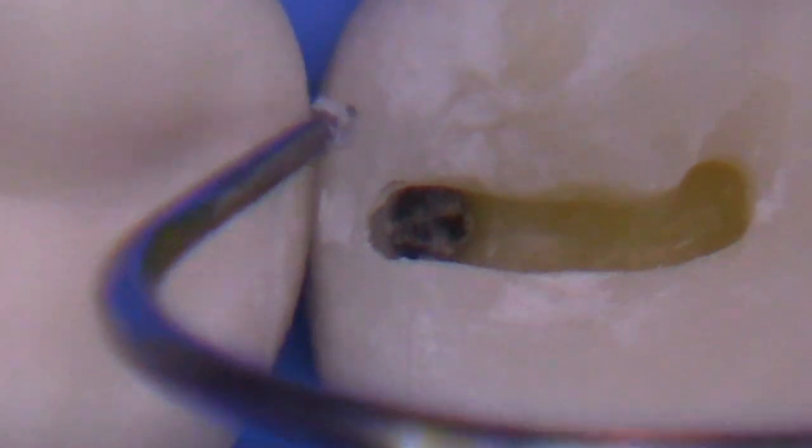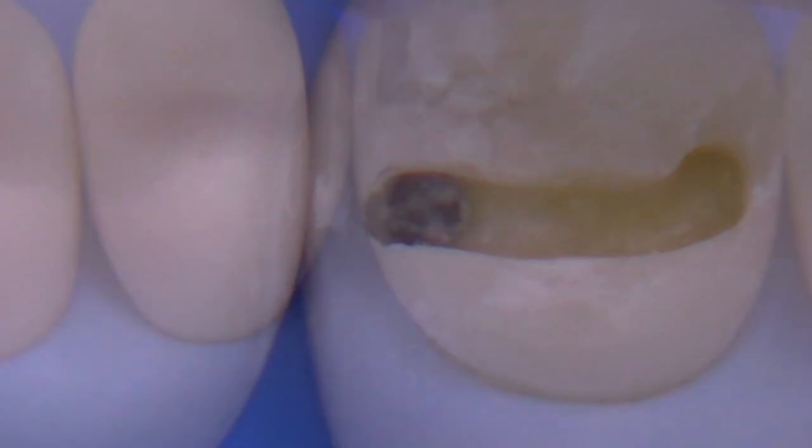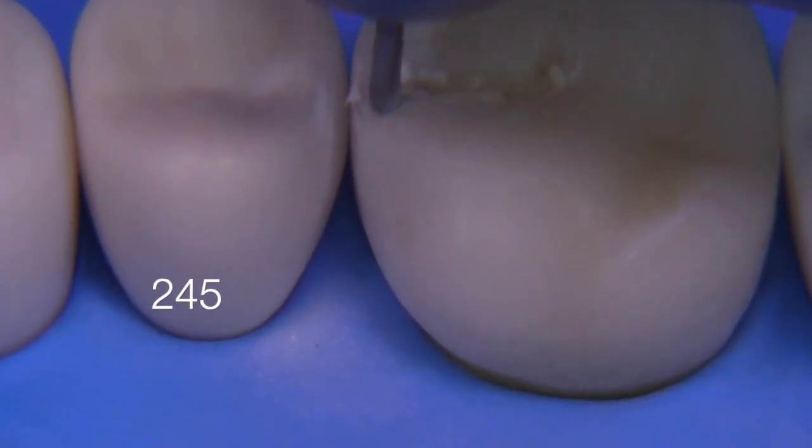Let's take a look at what the caries looks like from the occlusal. This is pretty good — I think if you're in dental school and you want to know what a tooth could look like when you break into the caries, this is very much what I would expect to see clinically.